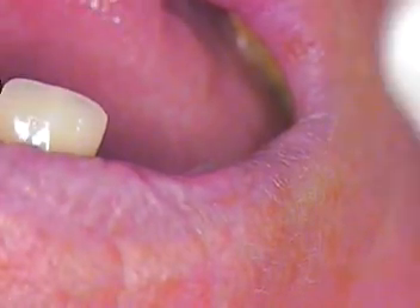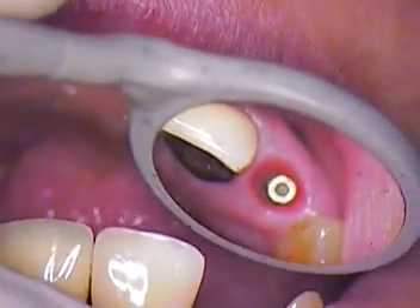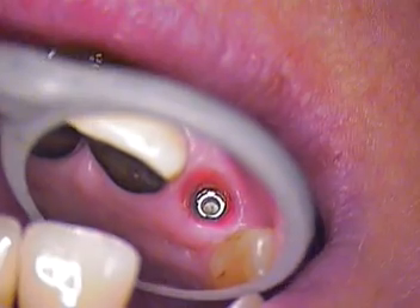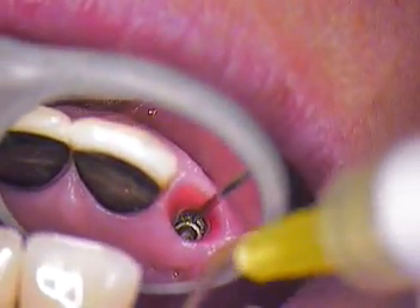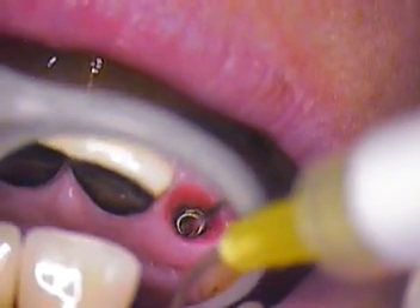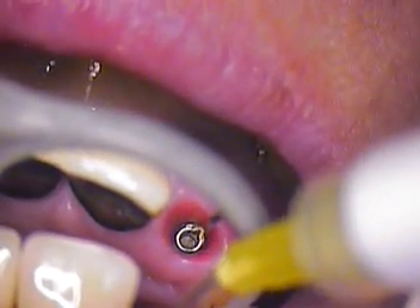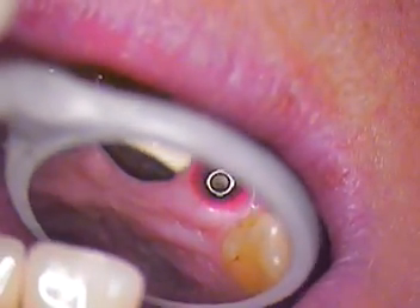Microsuction please, thank you. Look at the tissue — that is amazing. Look at how that tissue looks so pink and so nice and healed. We made that custom impression abutment. We copied the profile of the temporary and we took that impression with the open tray, and that worked out really well.